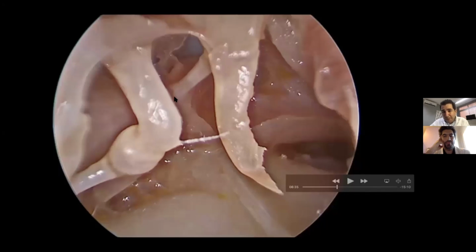So this is the tympanic isthmus. In this image it's very clear because you can see the three main ventilation routes. One ventilation route goes in this position, and most of the time is closed. The second one, which is the most important ventilation route, goes between the cochleariform process and the incudostapedial joint, and we call it the tympanic isthmus. And the third ventilation route, which is also important, we call the posterior isthmus, which goes from the incudostapedial joint to the facial recess region.